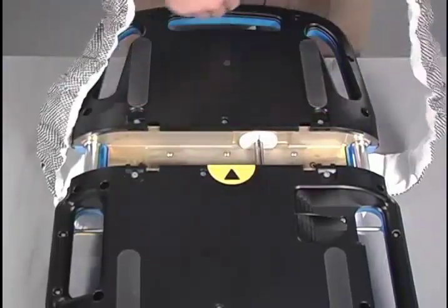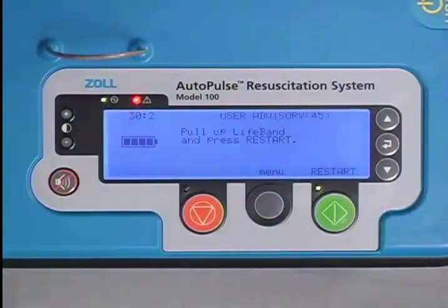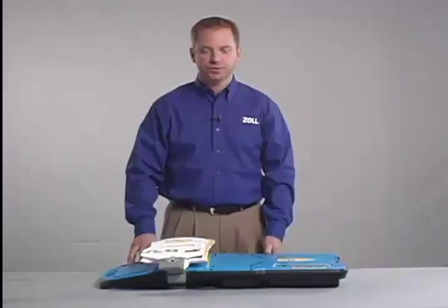If there is a user advisory number 45 on the screen, press the green restart button and attempt to clear the advisory. If the user advisory number 45 does not clear, contact Technical Service for assistance.